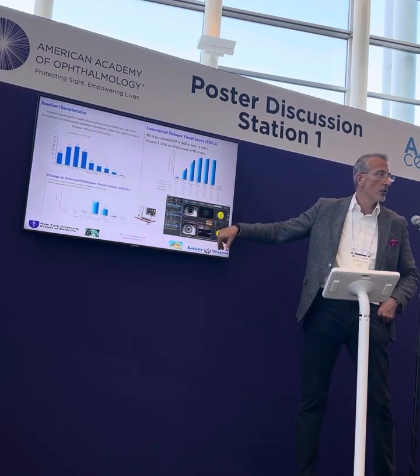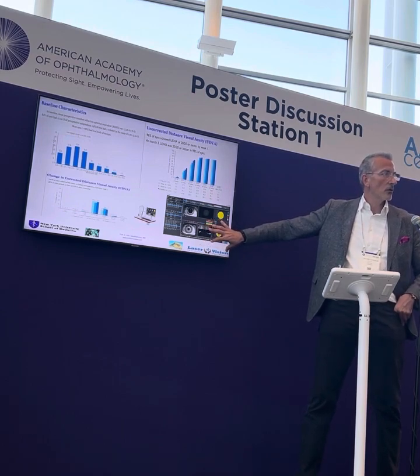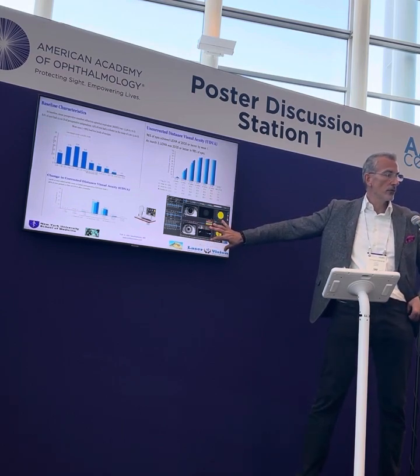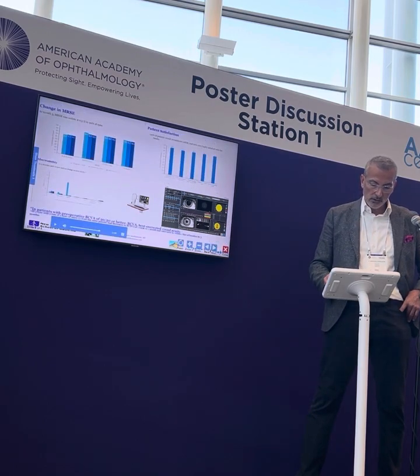This is kind of what the display of the Sightmap, this is what it's called in Alcon WaveLight language, and I do consult for Alcon, so I do have financial interest in this presentation as far as a consultant.